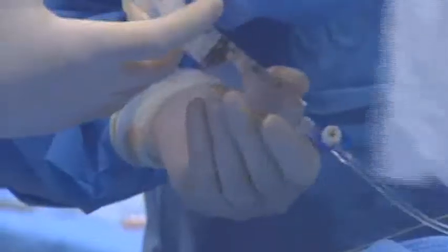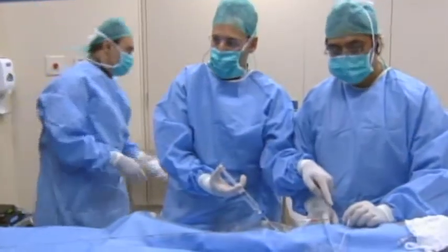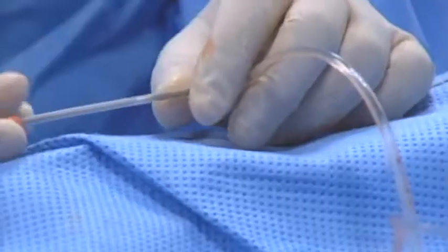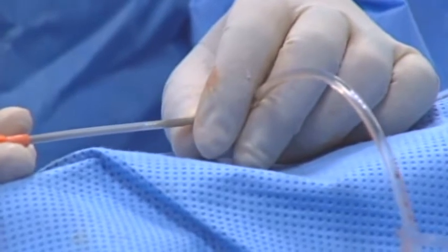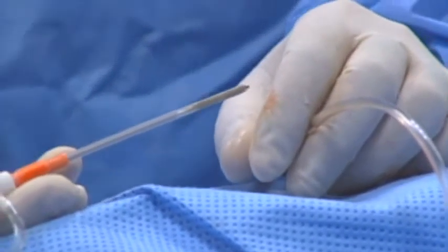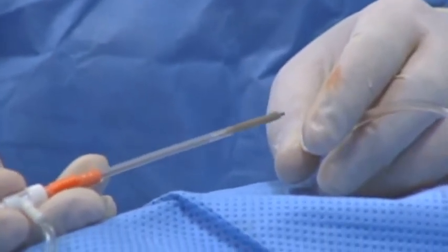With the LifeTech device, we have three different types. This is the type 1, where the discs are exactly the same, and we have the type 2, with the left ventricular disc bigger than the right, and we have the asymmetric one.